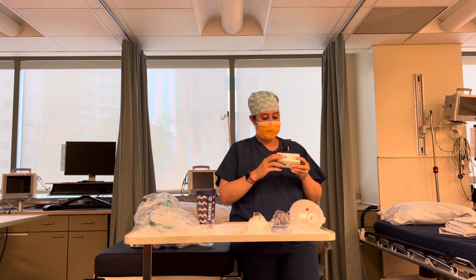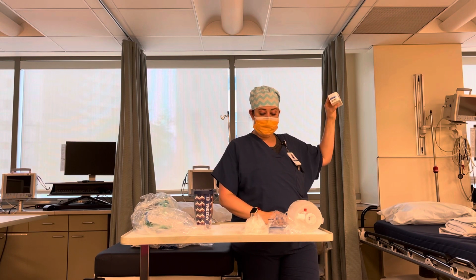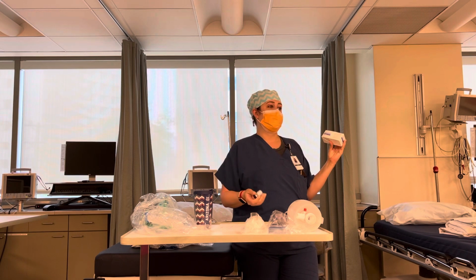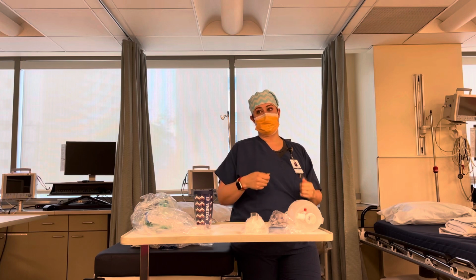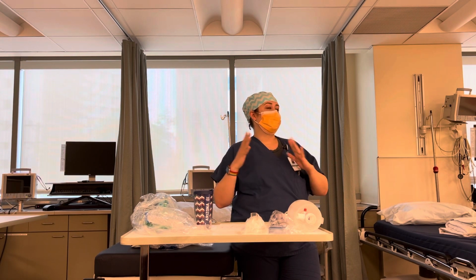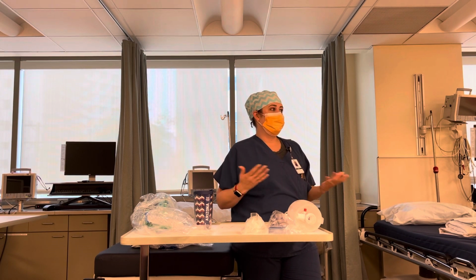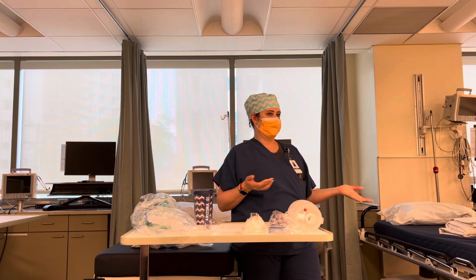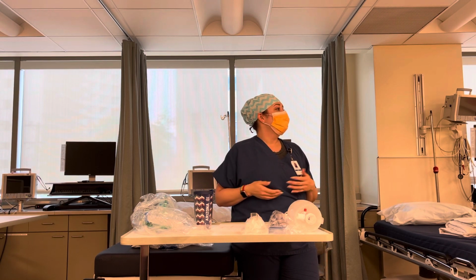This is what it looks like. It comes in this box, Rocuronium. I have started, with all of our new nursing staff, just pulling one at the beginning of the day, and I'm keeping it on the top of my cart, taped to the top of my cart with a 5cc syringe right there. Technically, it has to be refrigerated if you're not going to use it within a certain time period. In the ORs, in the hospitals, we have it stocked unrefrigerated in our Pyxis in our cart, but we go through it like one per surgery, so it's okay.